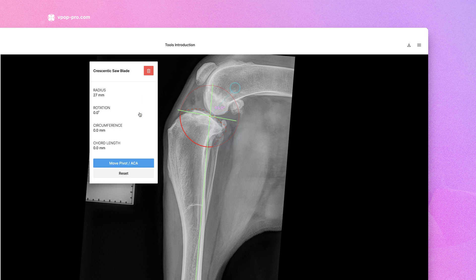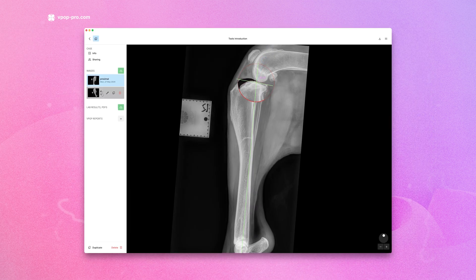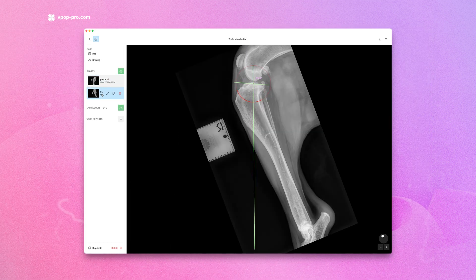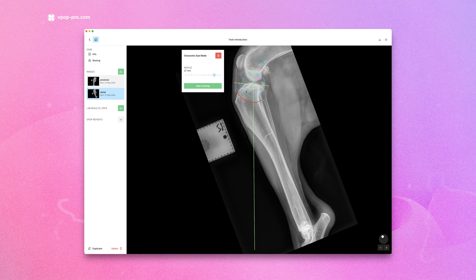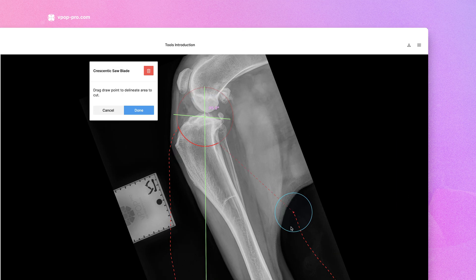If you define a proximal portion, you can rotate to a target joint orientation line. Alternatively, you can delineate a distal portion and rotate to a target mechanical axis to suit your planning style.